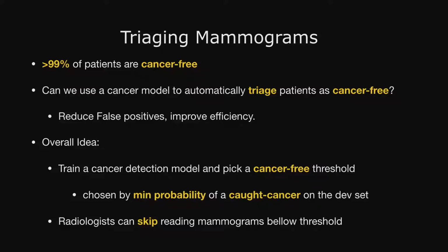And so there's a natural question that can come up: what can you do in terms of modeling, if you have an even okay cancer detection model, to raise the incidence of this population by automatically reading a portion of the population as healthy? Does everybody just follow that broad idea? Okay, that's enough head nods.